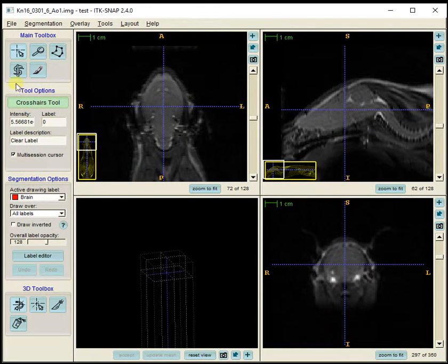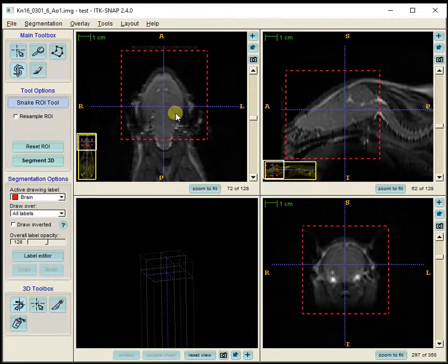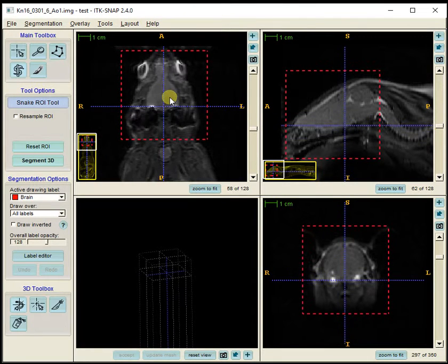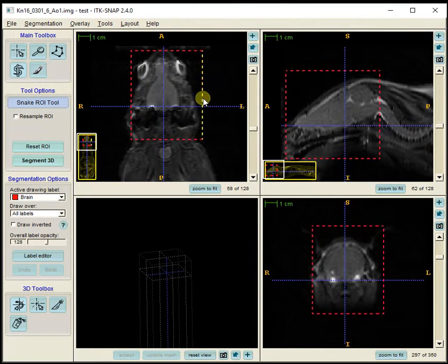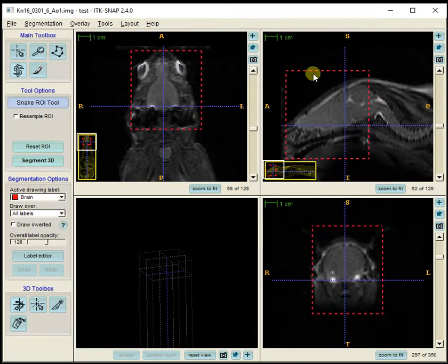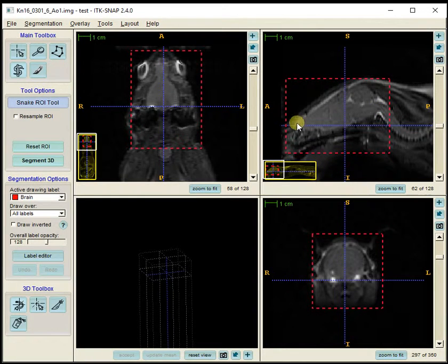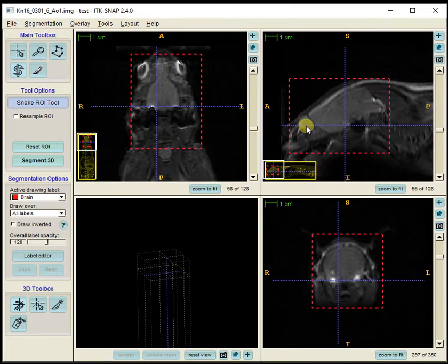When I go back to the snake tool, the ROI is still there. I want to get this as close to the brain as possible, including the olfactory bulb. That looks pretty good.